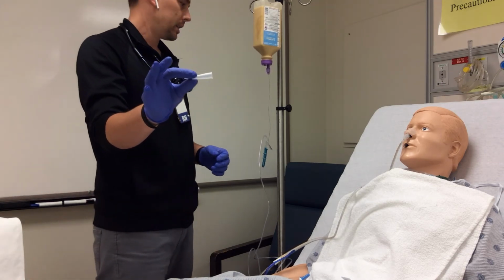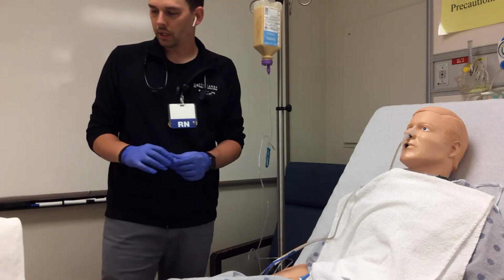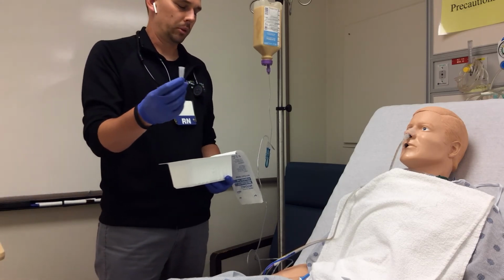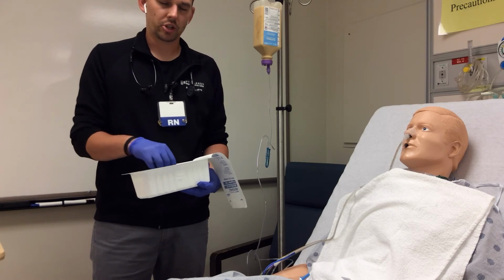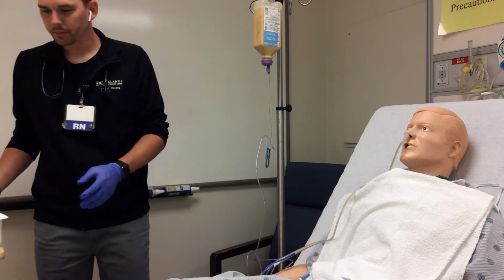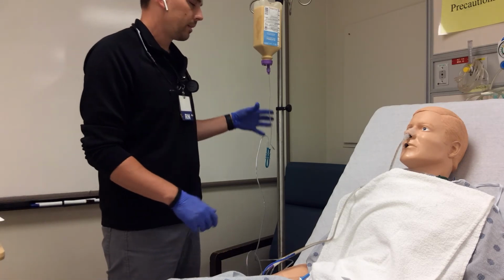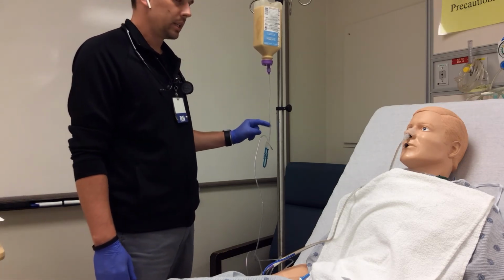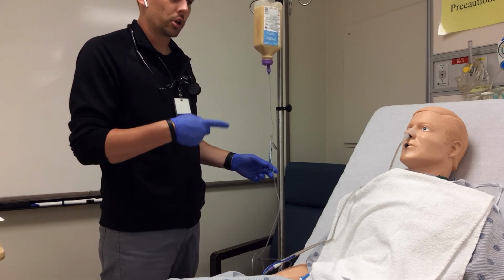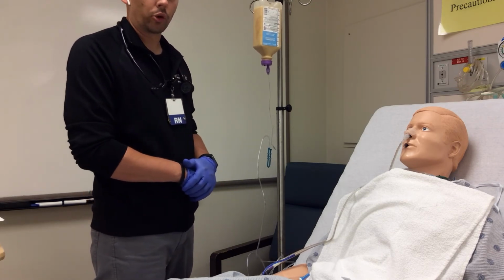I would suggest holding onto this cap for the tubing somewhere safe, whether you put it in your irrigation tray, in case you need to disconnect it, especially when flushing or checking gastric residual volume. From here, we already have our pump set. We're just going to hit the run button, and we are going to monitor our patient and make sure that it's starting to infuse appropriately.